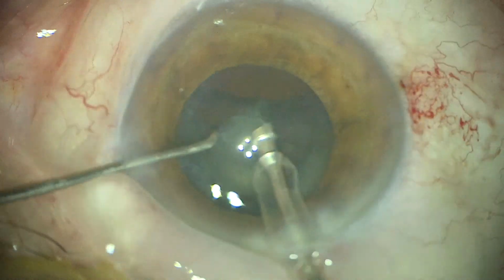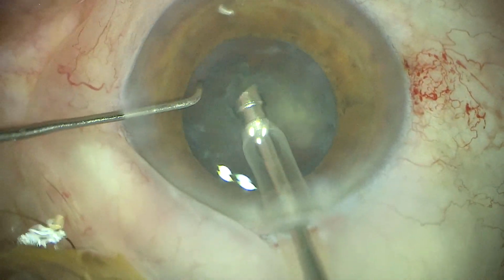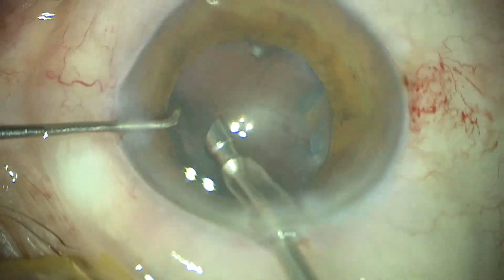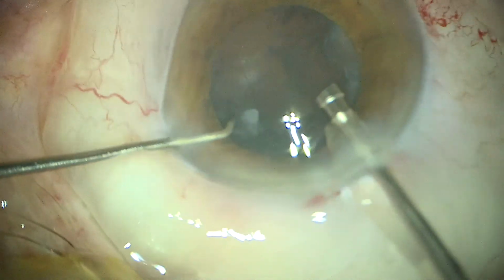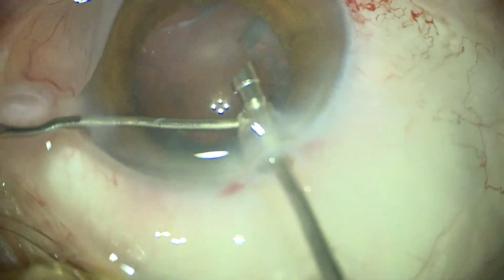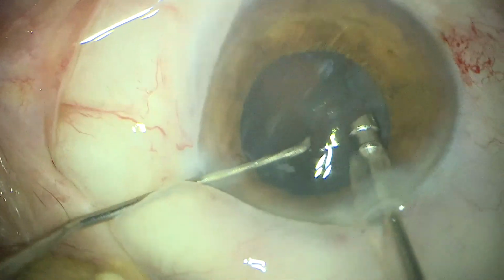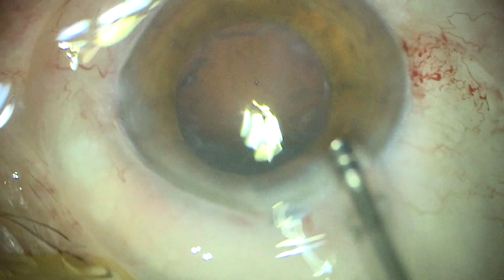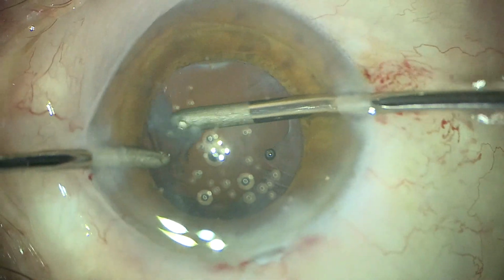This can be done quite easily in this case. We don't have any problem with the pupil. The surgery is done under drop anesthesia, and with a little bit of flip we can lift the whole epinucleus to the anterior chamber, mainly using vacuum and less phaco.